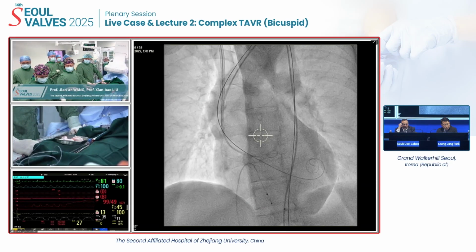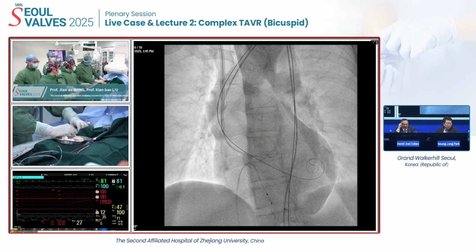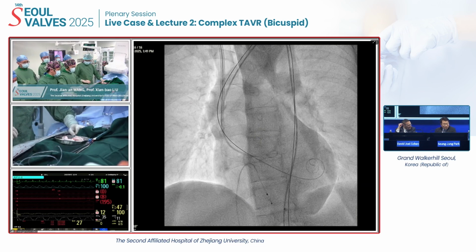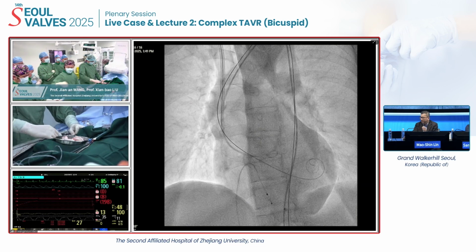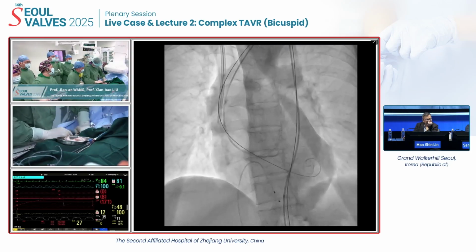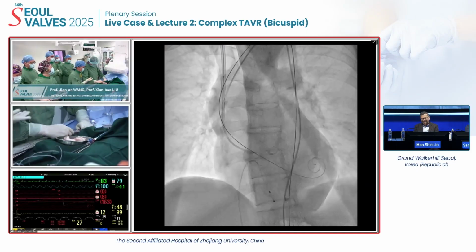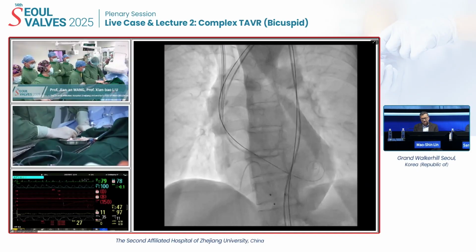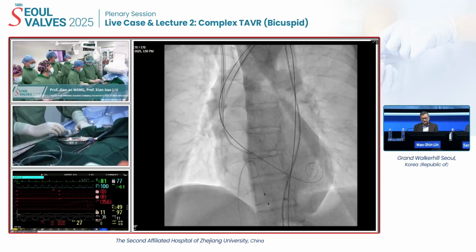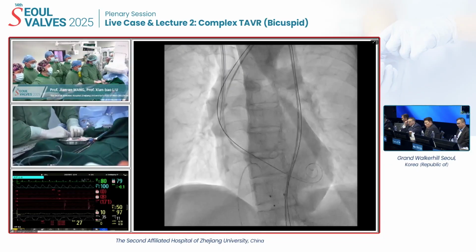Homegrown sheath. Okay. Professor Wang and Liu, is this domestic balloon expandable valve from China different from the Sapien valve? Okay, I invite Dr. Liu to answer the question. Yeah. So the sheath is different, and the valve is also already loaded. So it's mounted on the balloon. You can see right here.